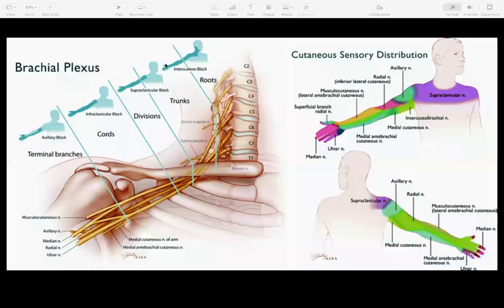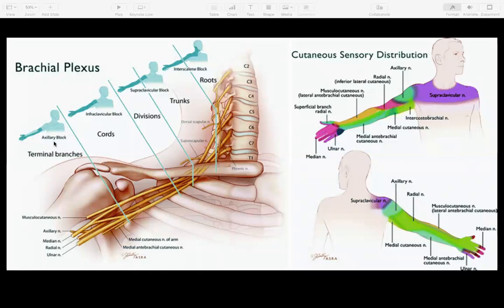I like to picture where exactly along the plexus we're blocking. The interscalene block is performed generally around the level of the roots. The supraclavicular block is at the border between trunks and divisions — so you might see trunks, divisions, or a bit of both on your ultrasound. The infraclavicular block won't be covered in this session. The axillary block is all the way down at the terminal branches of the plexus, where you can actually pick out the individual branches.